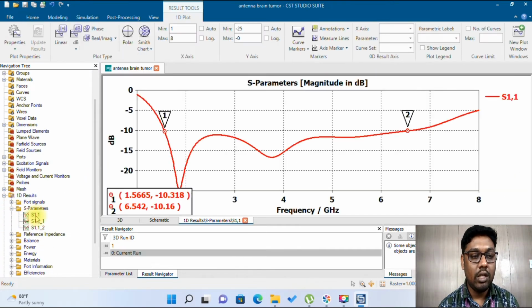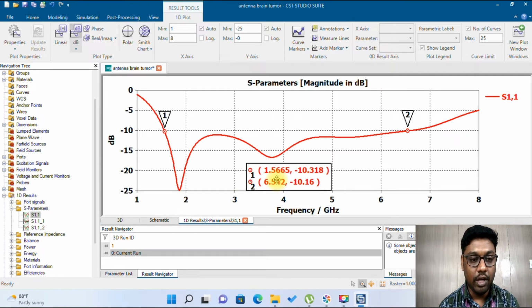Once the simulation is complete, we can see the S11, that is frequency versus reflection coefficient. We track minus 10 dB on the y-axis, and if you draw a straight horizontal line across this graph, it cuts the graph at 2 points, which I have marked as point 1 and point 2. Point 1 is the lower band frequency, around 1.5 gigahertz, and point 2, where the minus 10 dB line cuts the graph again, is around 6.5 gigahertz. So around 5 gigahertz bandwidth is achieved in this design, which we can call ultra wideband.